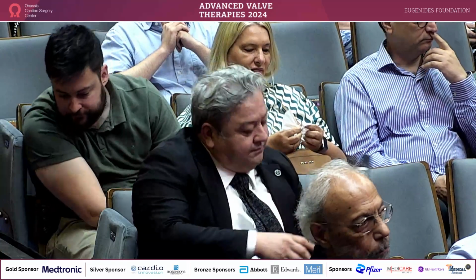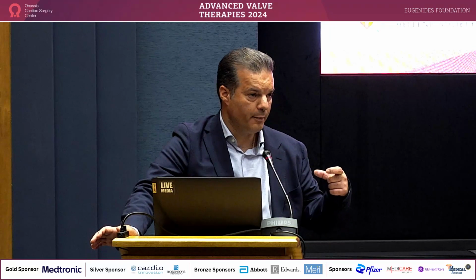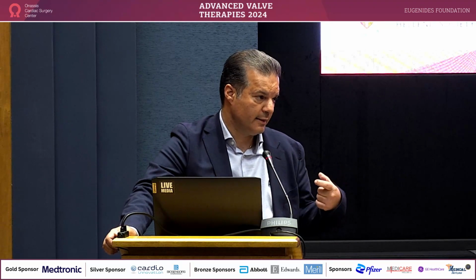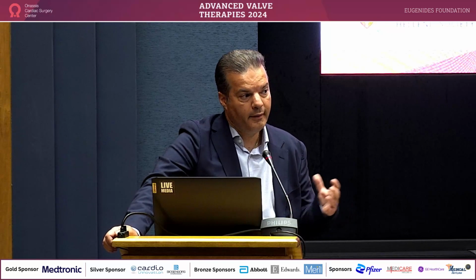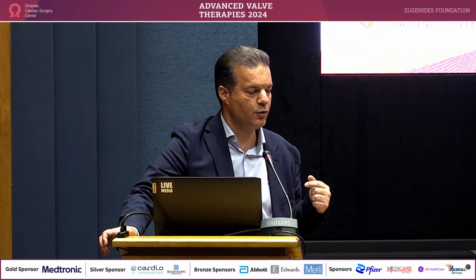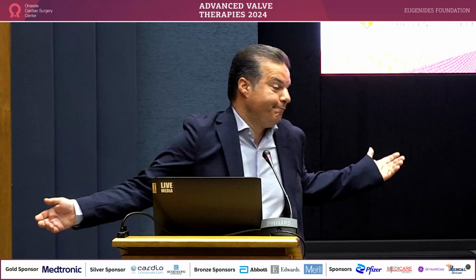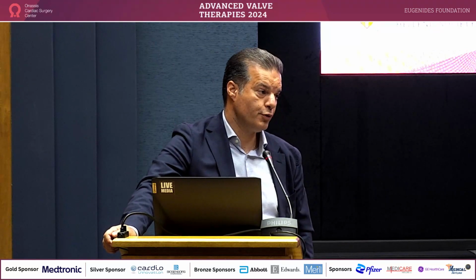That's absolutely right. All the cases that I've seen were with a hard stop, either a prosthetic valve or a complete ring. This is probably one of the first cases that is done in MAC, but the concept is there. Of course, it's a big concern. In order to avoid this potential, we undersized the valve. So we went to a 29 instead of 30.5 because we didn't want to overexpand it. But you're absolutely right. We have to explore this field and see if there is any future in it.